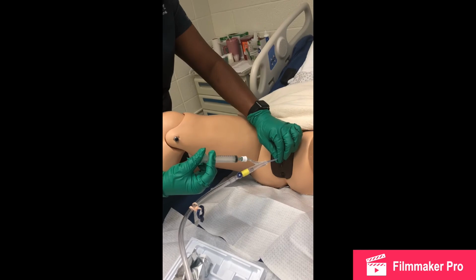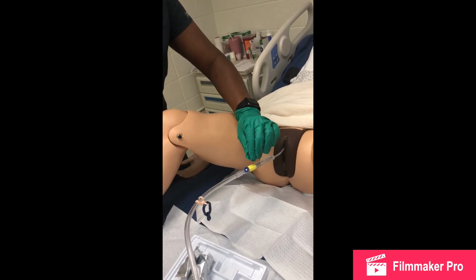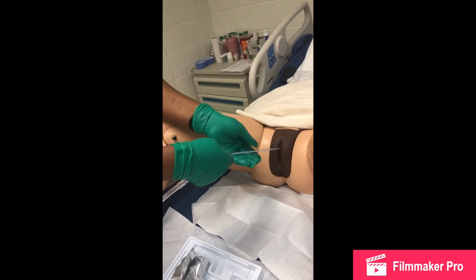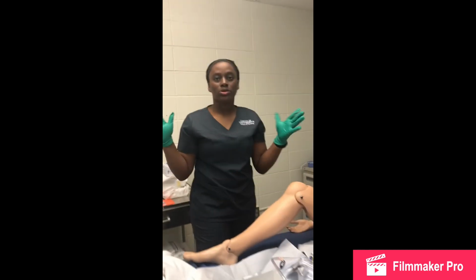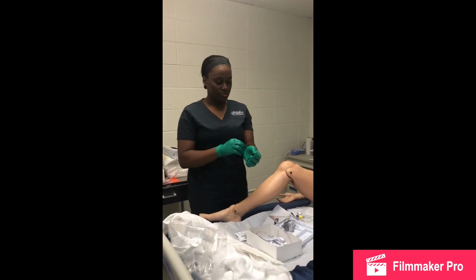Once I've inserted my fluid, I'm going to carefully take this part off and pull out until I meet resistance. So now that I meet resistance, I can now take my sterile gloves off because the sterile procedure is done.